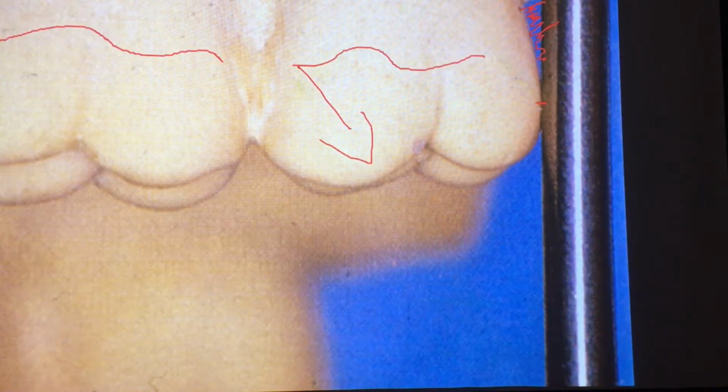contour as such. And this height of contour is marked, you guessed it, with the carbon marker that we have in our surveying kit. Once we analyze the correct path of insertion, then we'll swap that out for our graphite, and then we will actually mark the height of contour, not just on our abutment teeth. As an exercise, we'll make a height of contour on all the teeth.